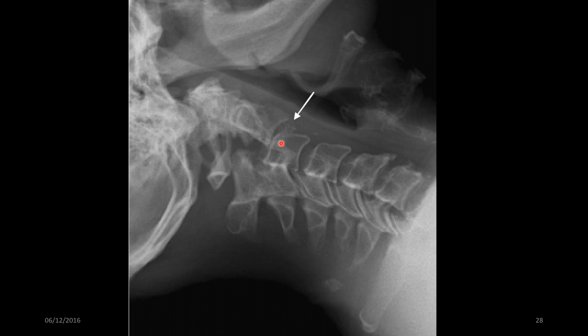Now, another reason why we do portables is serious considerations for patient management. If somebody's got that, you can't be rolling them around, sliding them up and down, sitting them up and down.